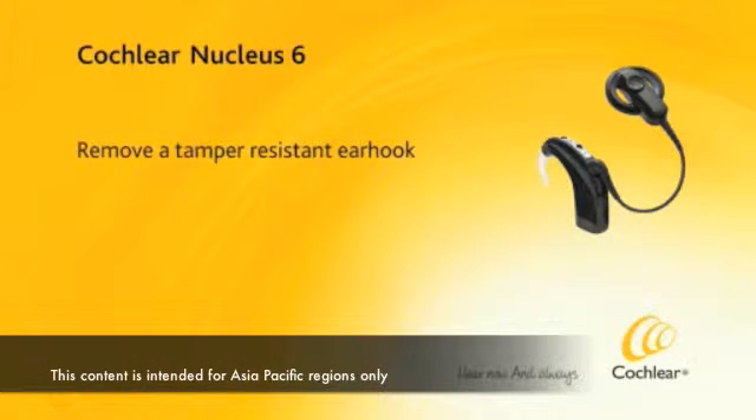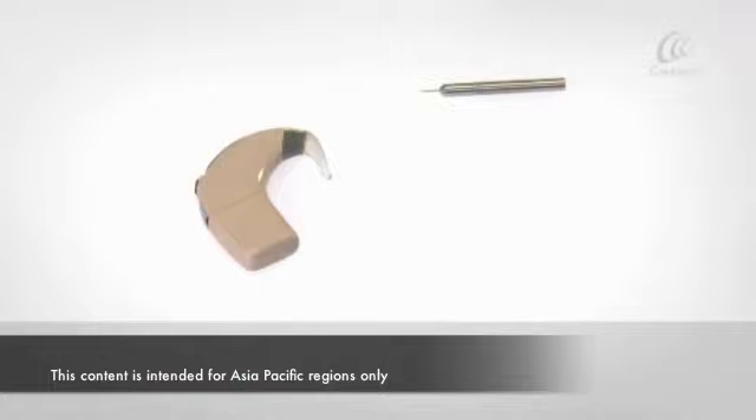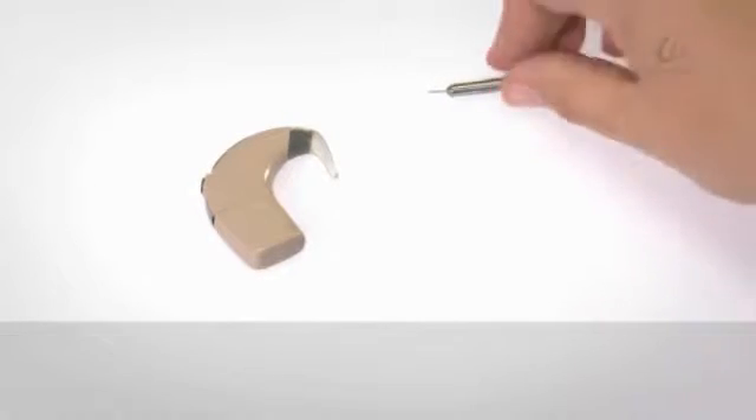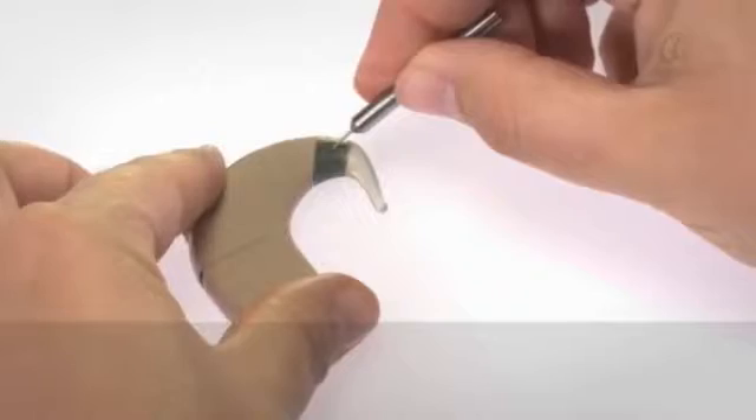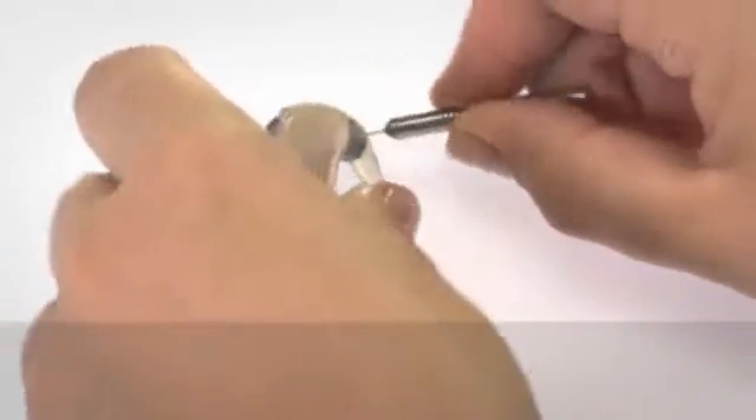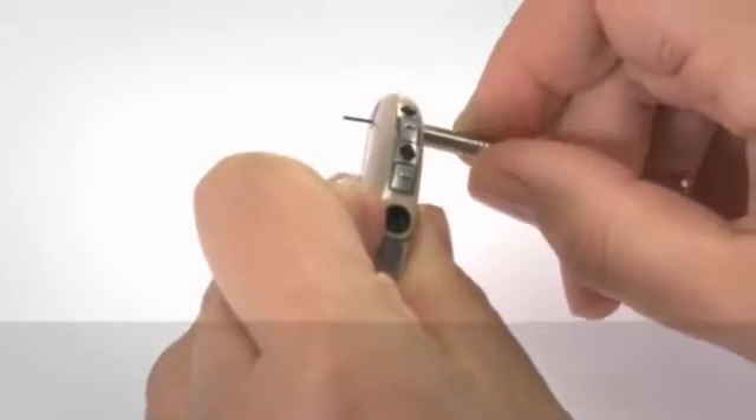To remove the tamper-resistant earhook, insert the pointed end of the locking tool into the hole on the earhook. Push the tool into the hole to partly remove the fitting pin.